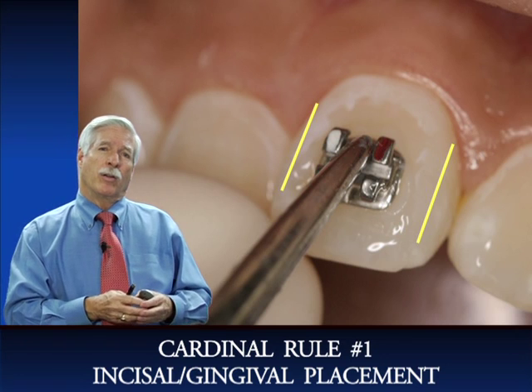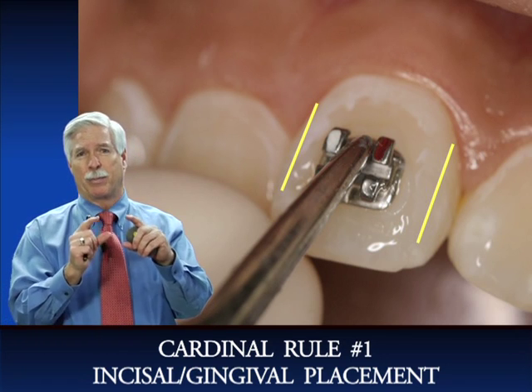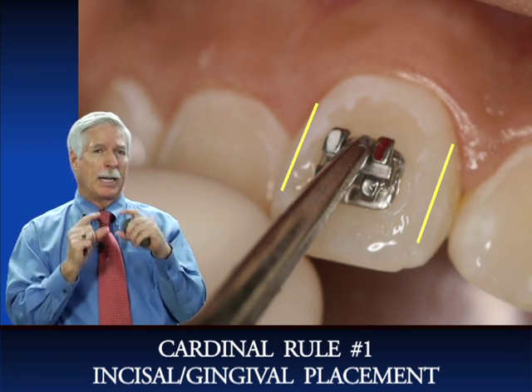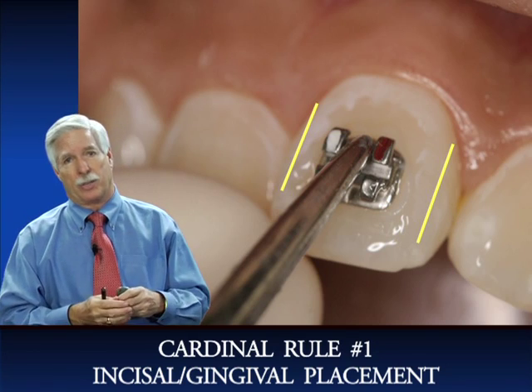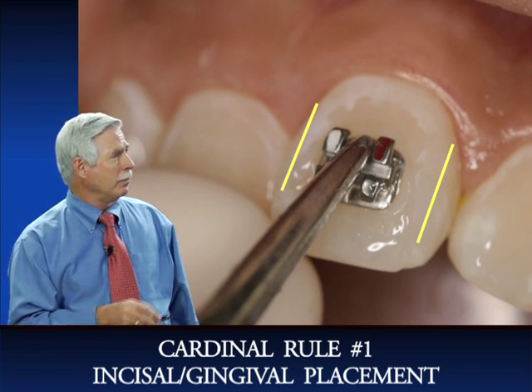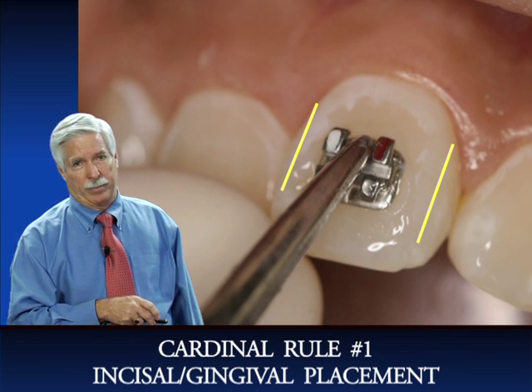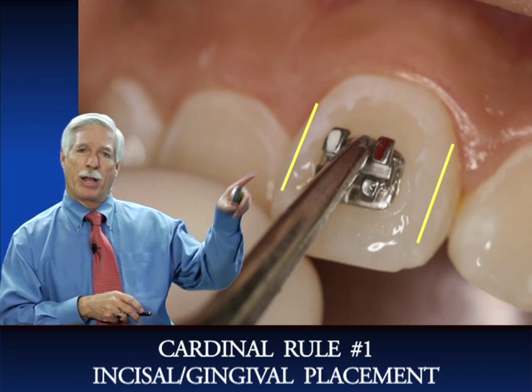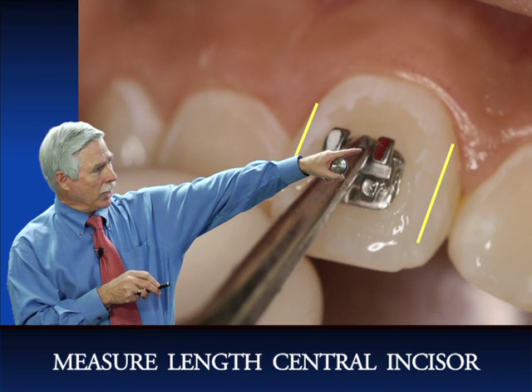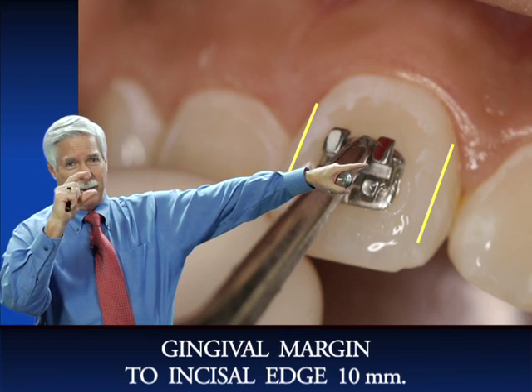Now let's go over the cardinal rules for bracket placement, because this is key. The bonding procedure is extremely important, and that's why I'm going over this with you, but placing the bracket in the correct position on the tooth is also extremely important. So cardinal rule number 1 is place the bracket correctly incisogingivally. What we do is measure the length of the central incisor. Say that central incisor from the gingival margin to the incisal edge is 10 millimeters long.